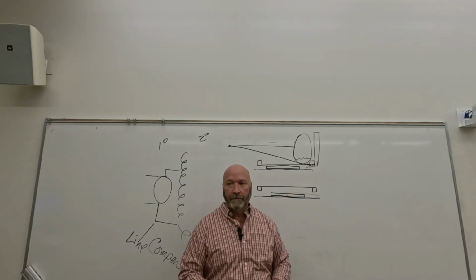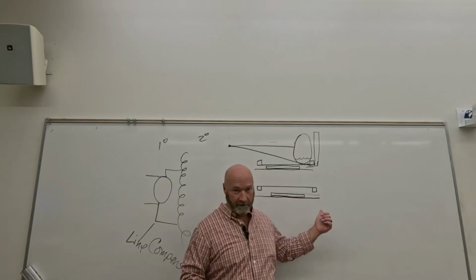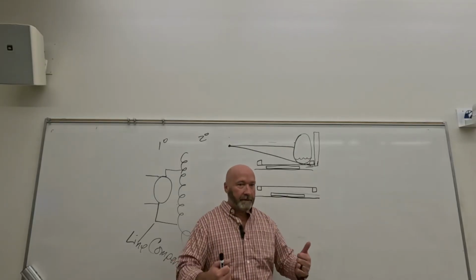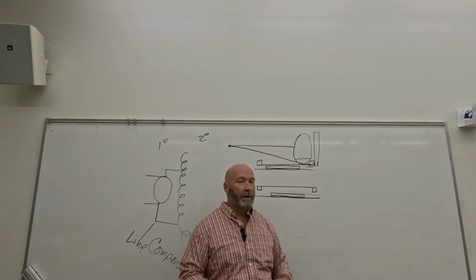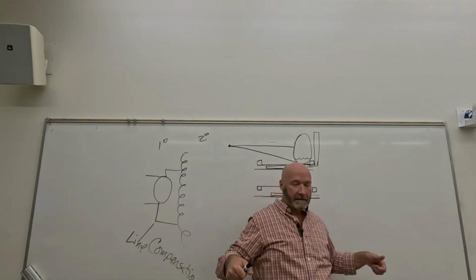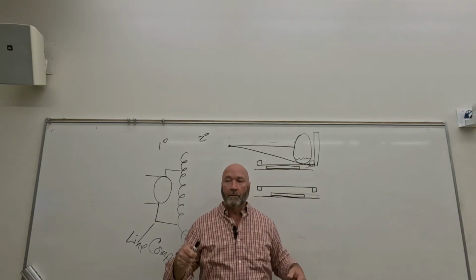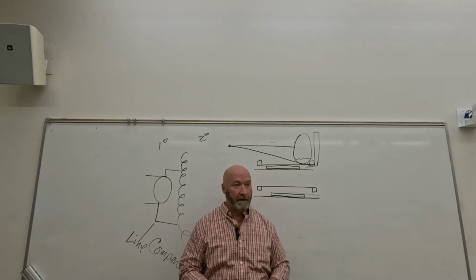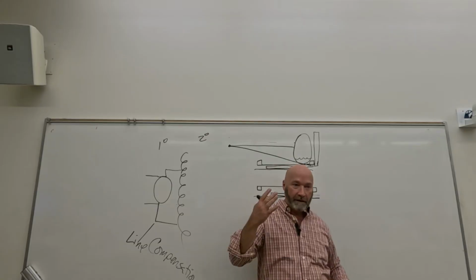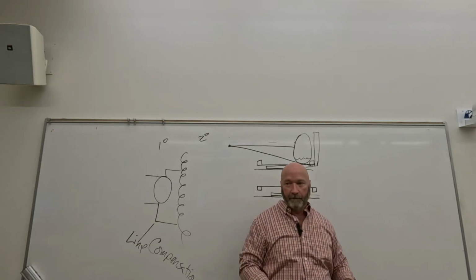What I recommend is, if you're doing an upper GI, and even if somebody else put the footboard on, try to jerk that thing off the bottom of the table. Because if they put it too high, it's going to slide before it catches, okay? And if they put it too low, it's going all the way to the floor, okay? So, you get an upper GI, and before you raise the table up, you grab that thing and you rock it and see if you can pull it off.